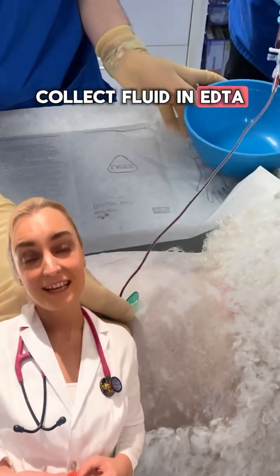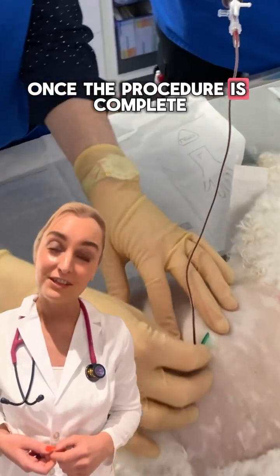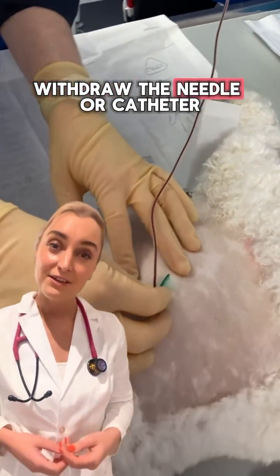Collect fluid in EDTA and serum tubes for analysis. Once the procedure is complete, withdraw the needle or catheter.